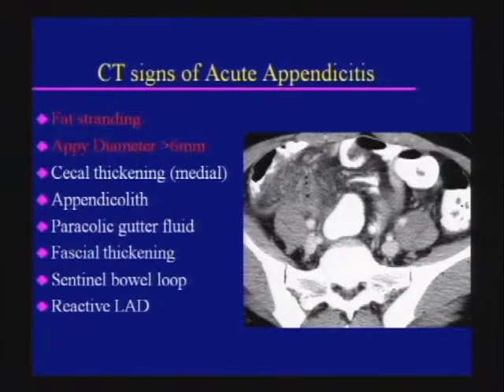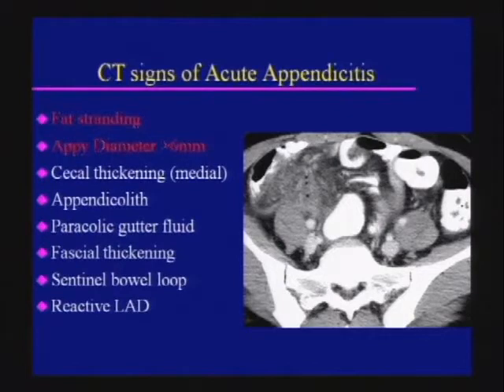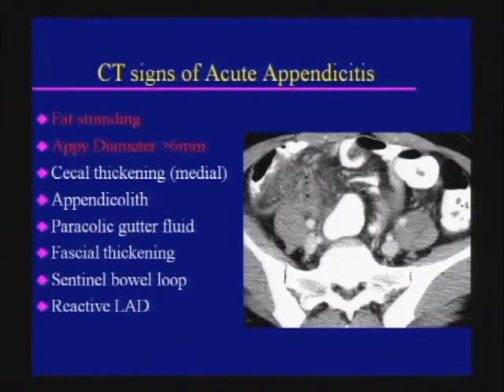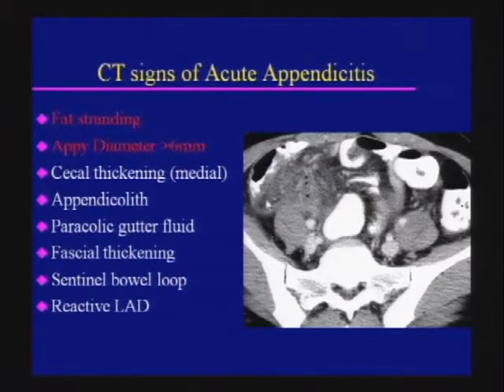The CT signs of acute appendicitis: the first two are the most sensitive and specific findings. You want to call appendicitis if you see fat stranding in the peri-appendiceal region and an appendix with a diameter larger than six millimeters. You may also see cecal thickening — particularly the medial wall — an appendicolith, paracolic gutter fluid, fascial thickening along the lateral conal fascia, a sentinel bowel loop, and reactive lymph nodes.